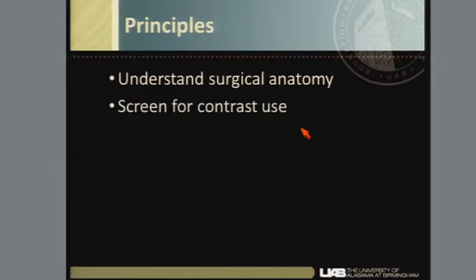I think that's important. We need to screen these patients just like we do when they roll into CT to get intravenous contrast. Most of these studies are going to be water-soluble contrast. They have the same risk profile as the intravenous contrast agents. We know that small volumes of these agents are resorbed across the GI mucosa. We know this is increased in post-operative patients, and we know that anaphylactoid reactions are not volume dependent, so these patients need to be screened.